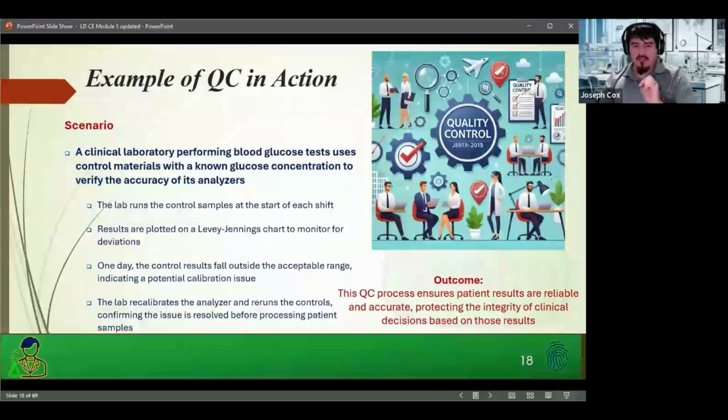The way the instruments are set up, they basically process it in real time and shoot out the results. So if you run without QC passing, results will still get populated. They're still going to go somewhere. It's not like when you run on the LC, then analyze the data, and then send out a report somewhere. No, these instruments are going to send data. So if you run a patient sample, it's going to send data out. If you run without passing your QC, there are going to be results that can be accessible, and they can be accidentally sent out to the patient, or the doctor can use those results by accident without them being completely confirmed.